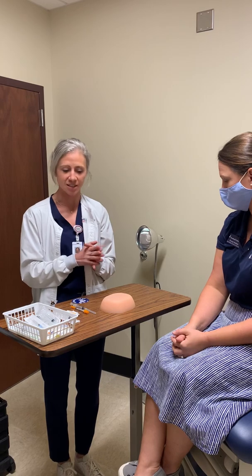This is Ms. Kubian. We're going to go into some more medication administration today. We're going to talk about injections. We're going to talk about intramuscular. By definition, we're entering into the muscle. We're going to talk about subcutaneous injections, which is going to be into the subcutaneous tissue. And we're going to show you what needles we use and how we go about that. So we're going to start with subcutaneous, okay?